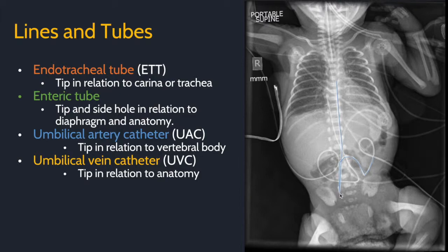The umbilical artery catheter, shown in blue, dives down to the iliac artery before going up the descending aorta. Describe the tip in relation to the nearest vertebral body. Counting down: T12, 11, 10, 9, 8, 7, 6, 5 — the umbilical artery catheter terminates in the region of T5.